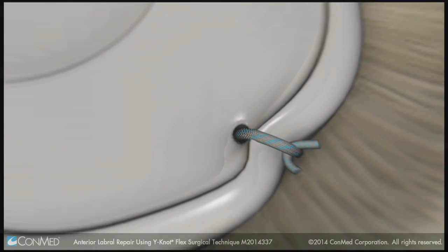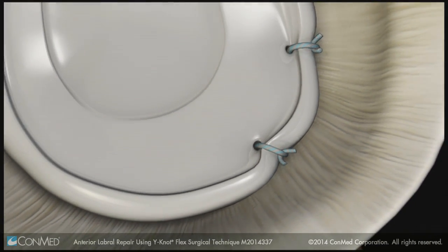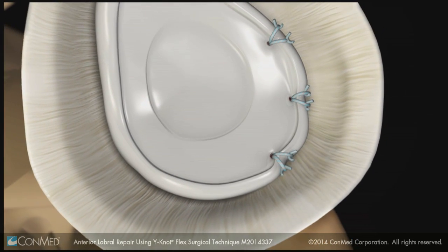Repeat the steps using additional anchors to complete the repair. Double-loaded Y-Knot All-Suture Anchors are also available.